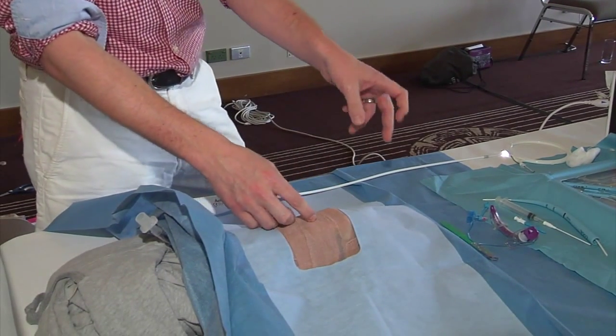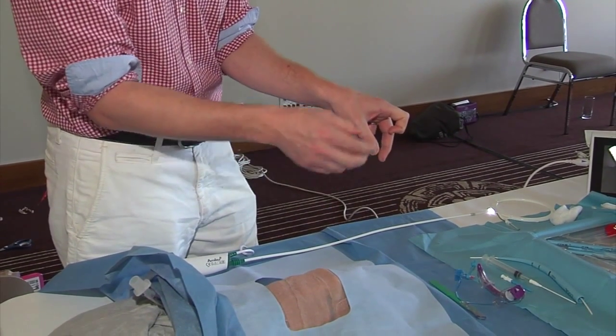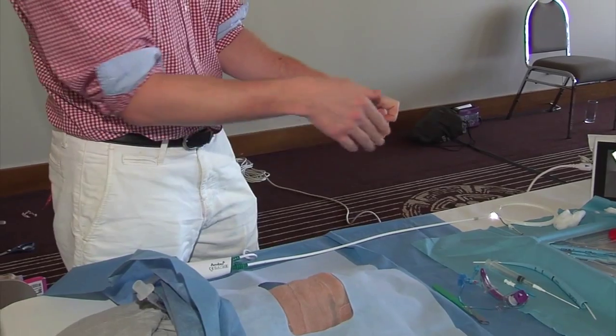When you're actually doing it, keep holding the cricoid ring at all times. That stabilises the trachea, stops it slipping from one side to the other, and gives you a tactile feeling of where the midline is, so you get the needle going in the middle.